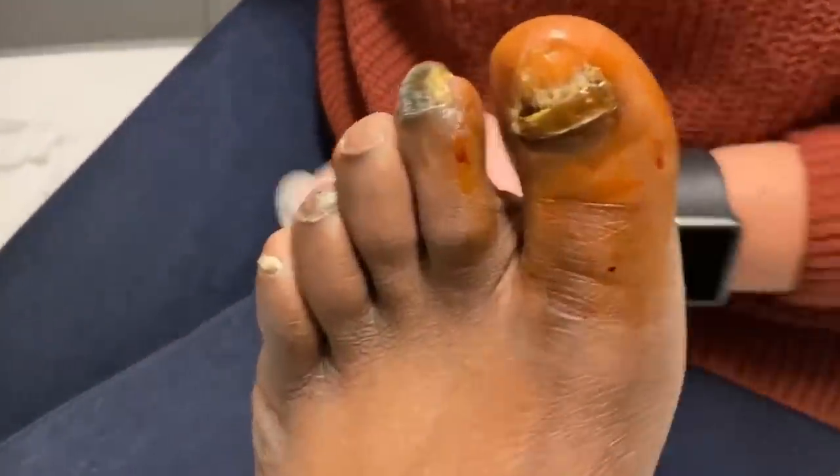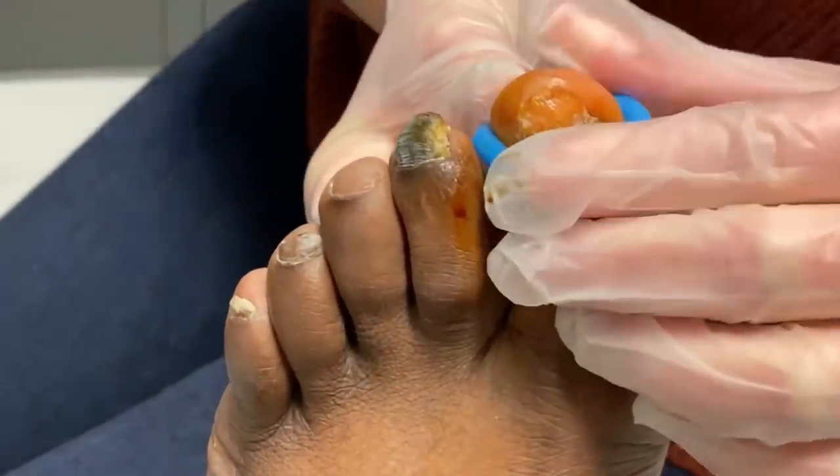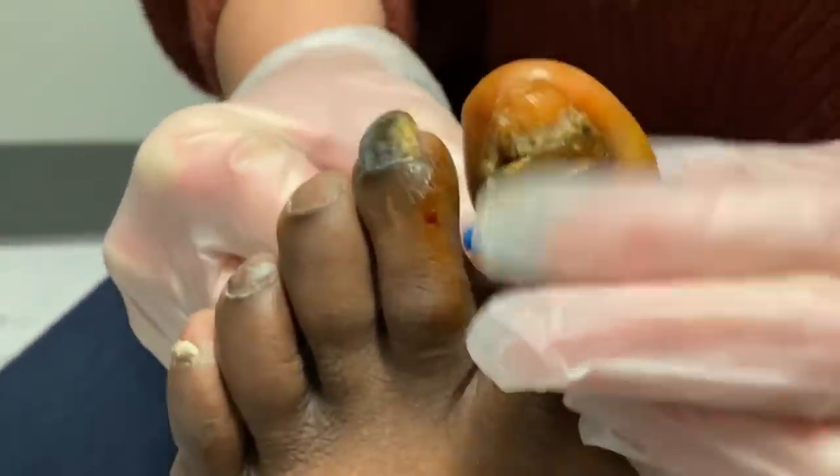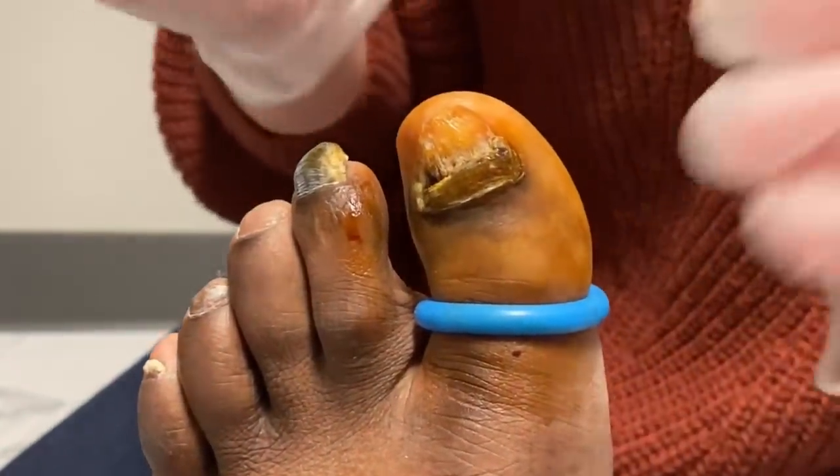Do the tourniquet here — put the tourniquet on first. This will just help with bleeding. You might feel that little pressure with that. Nice and numb. So again, feel pressure, no pain.